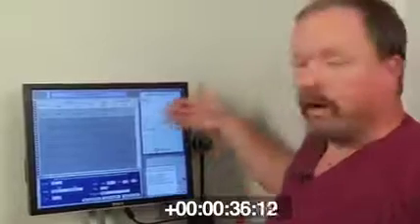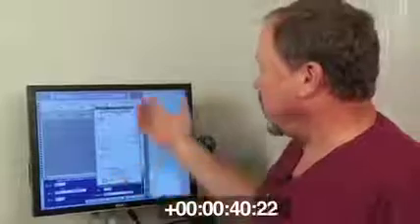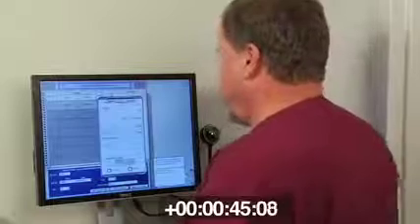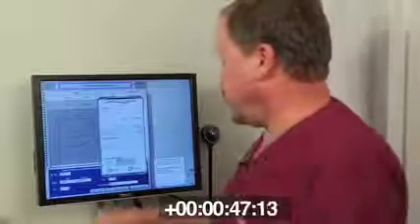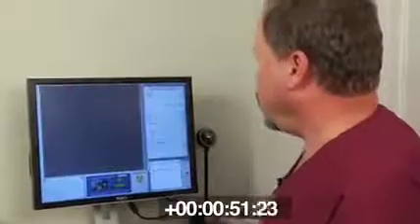It pops up over here on our other screen. We're going to select this patient here, and it's now going to ask us what the purpose of this scan is for. We'll just put perio here, and technician, in this case it's Dr. Dan, so we're going to put DD, and we're going to confirm.